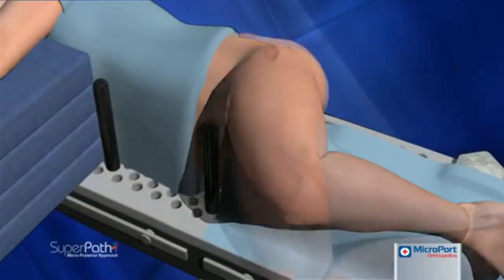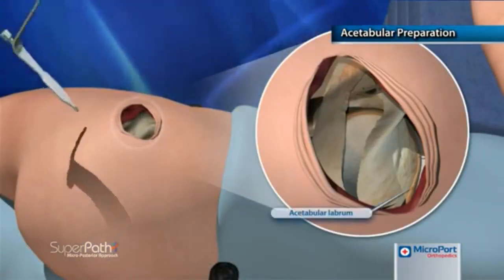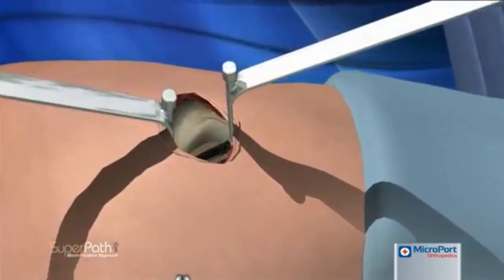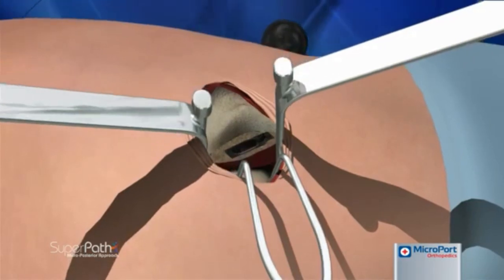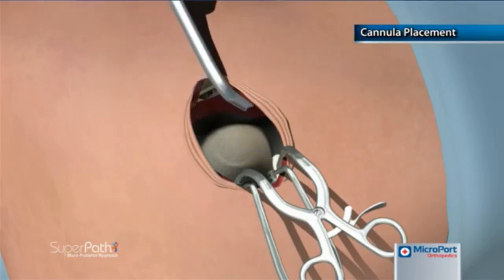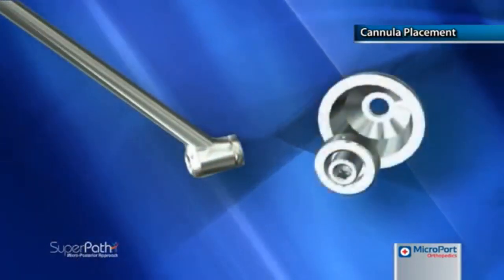With the operative leg returned to the original patient position, acetabular preparation begins. Two spiked Hohmanns are placed at the anterior and posterior sides of the acetabulum into the axilla between the capsule and the labrum. The labrum is removed as well as any remaining tissue from the acetabulum. A Zelpi retractor is placed subperiosteally at the acetabular margin at the proximal wound and a Romanelli retractor is placed immediately distal. The combination of these retractors provides rotational stability and a surface on which to introduce reamers into the joint. The spiked Hohmann retractors are removed. The tip of the bone hook is inserted into the broach to retract the femur anteriorly, and the alignment handle, portal placement guide, threaded cup adapter and trial cup assembly are seated in the acetabulum.